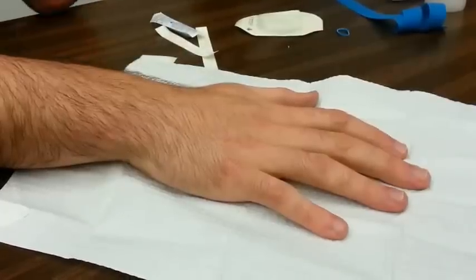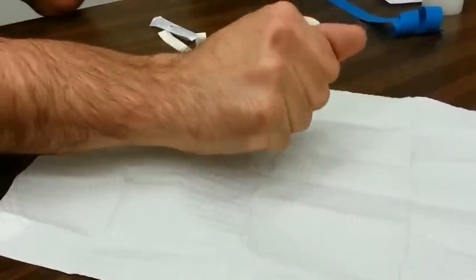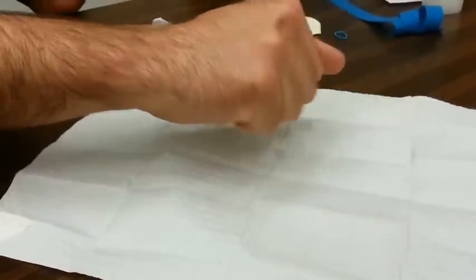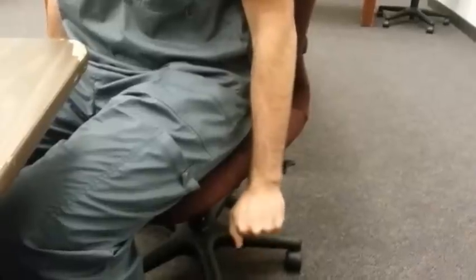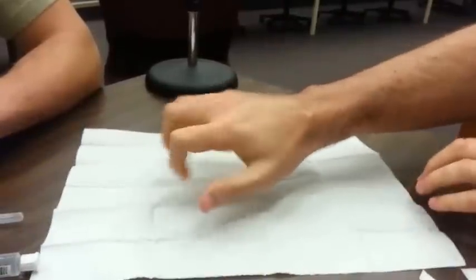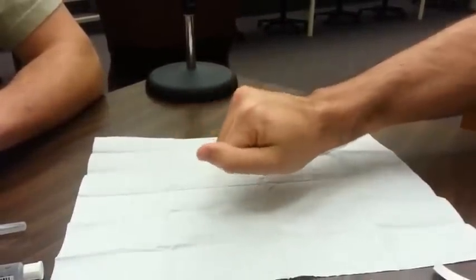There are a lot of tricks that seasoned IV veterans use to make veins bulge out. A few of the more common ones are to ask the patient to clench and unclench their hand into a fist for approximately 10 seconds. Another trick is to have the patient's hand and arm down by their side so gravity pulls the blood down into the extremity. Some people also prefer to tap a vein to get it to stick up. Don't spend too long looking for a good site, since patients expect you to know what you're doing.